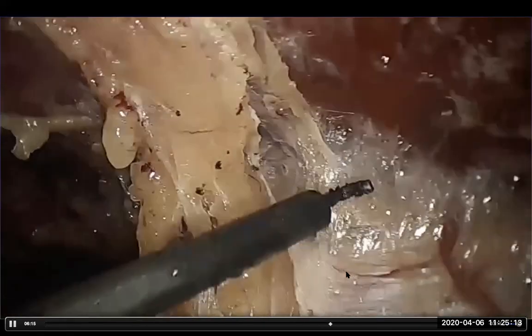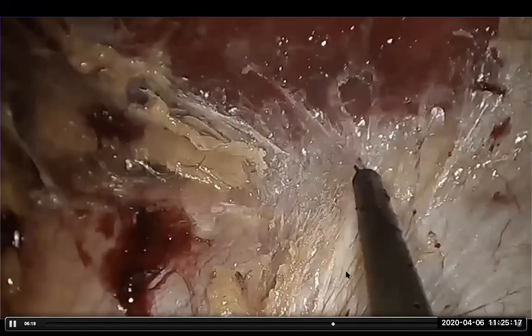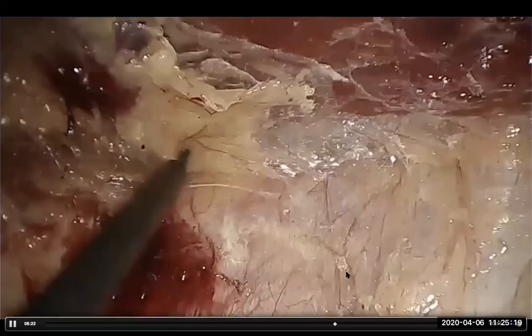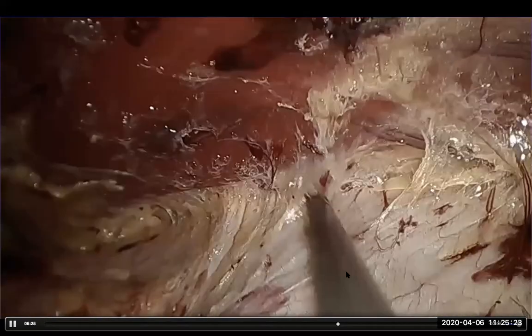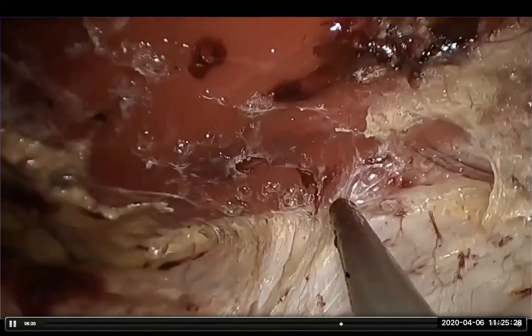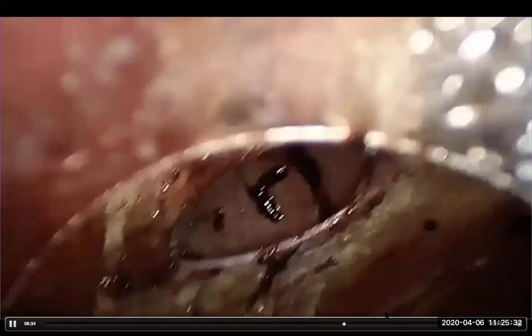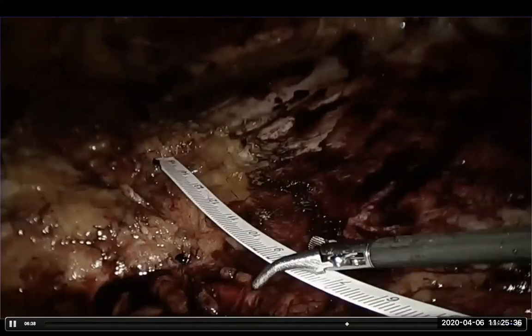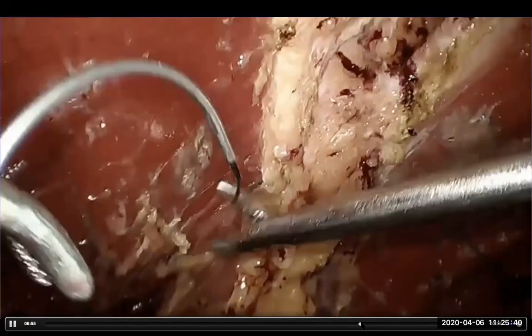So once you cross the hernia sac, you see that the inferior epigastric, which is staying up towards the ceiling, is the correct plane. And laterally, we are now seeing the neurovascular bundles and the linea semilunaris. So this is pretty much the same. And now you can see that the midline is exposed. We are measuring the space as before, and we are now closing the linea alba.